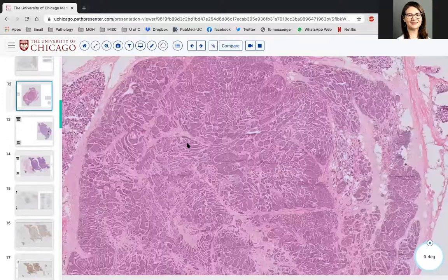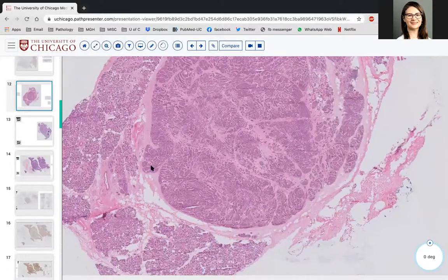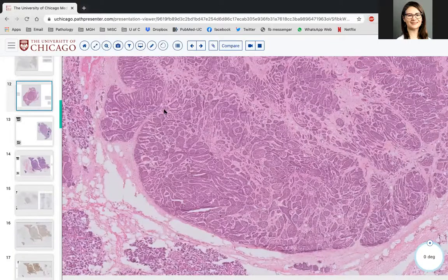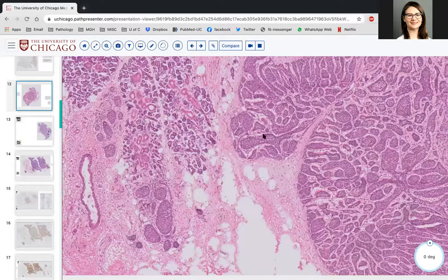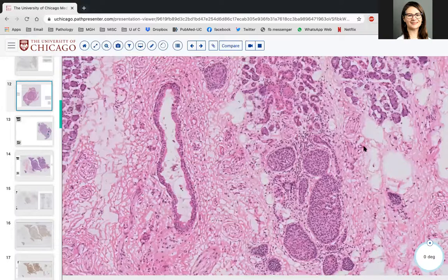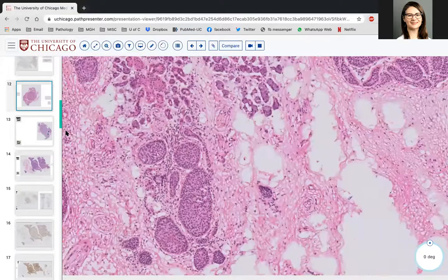This was sent intraoperatively, presumably because a firm diagnosis was not given on cytology, but more importantly, even if a firm diagnosis isn't given on cytology, sometimes they really want to know whether it's high grade or low grade, so that they can either do or not do the neck dissection. Invasion not present, totally missed that. Yeah, it's very focal, but you have to look around the whole periphery.